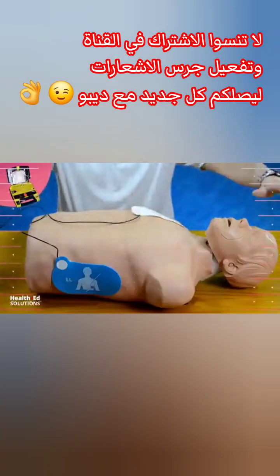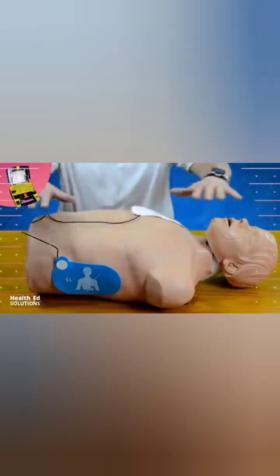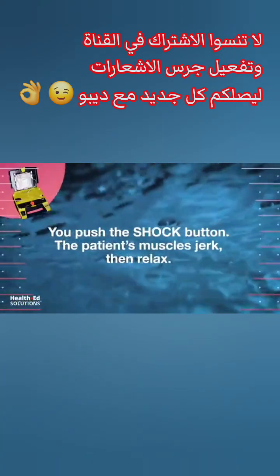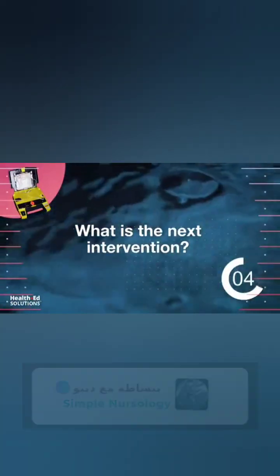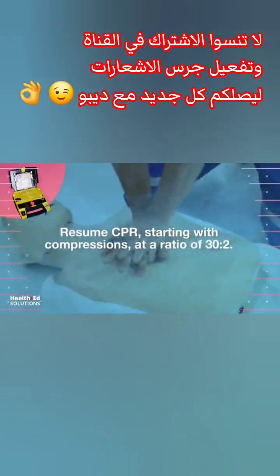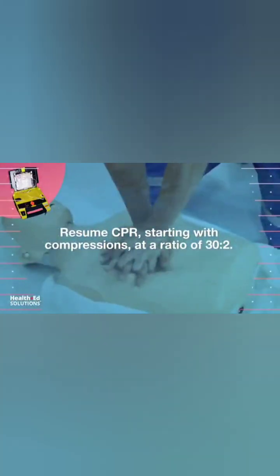Make sure to visually check while clearing the patient to ensure that no one is touching the patient, including you. You push the Shock button. The patient's muscles jerk, then relax. What is the next intervention? Resume CPR, starting with compressions, at a ratio of 30 to 2.